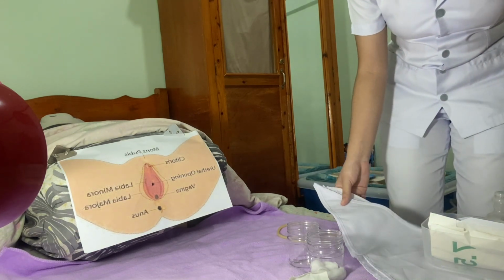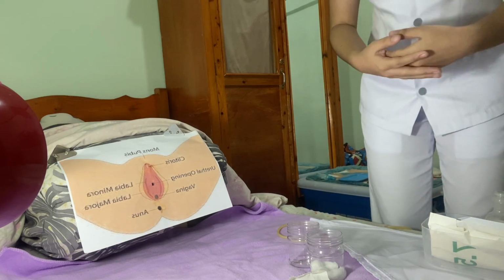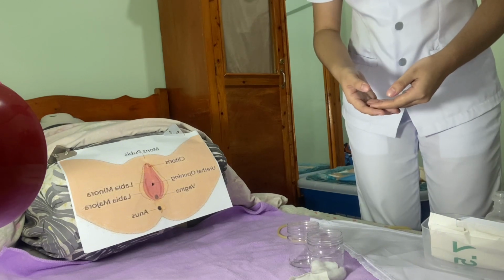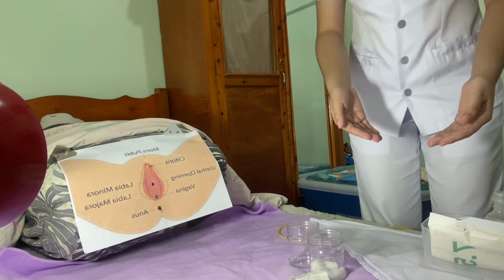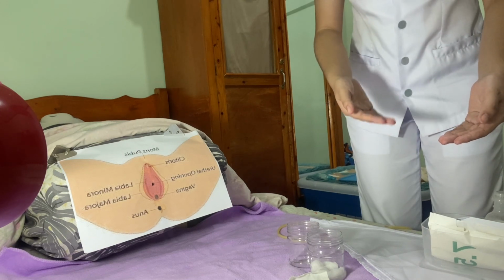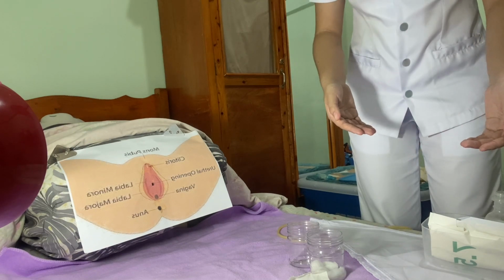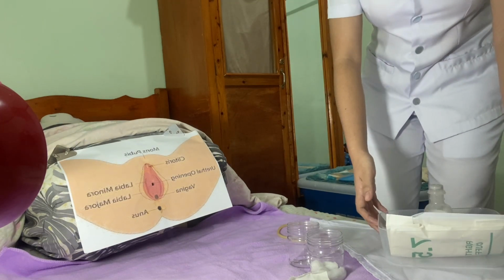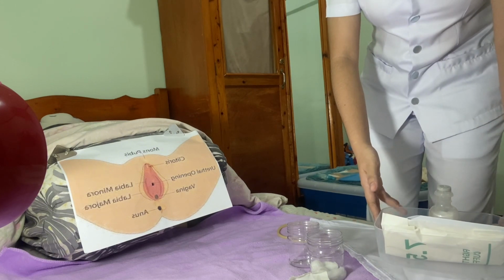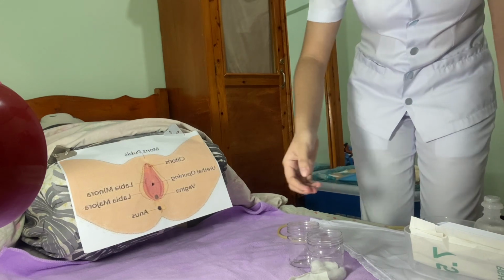So inside my catheterization set is my sterile gloves, an eye sheet, sterile cotton with a cleansing solution. I have a pre-filled syringe that contains 10 cc of sterile water, which I am going to use to inflate the balloon of the urinary catheter. I also have the sterile forceps for lubricant.